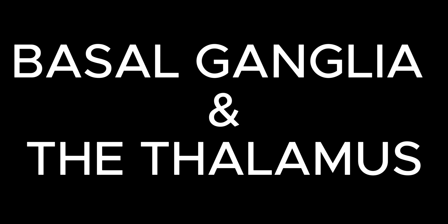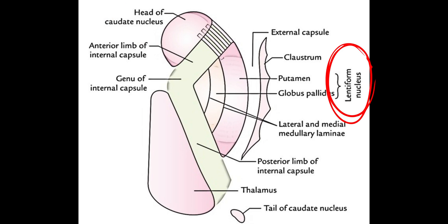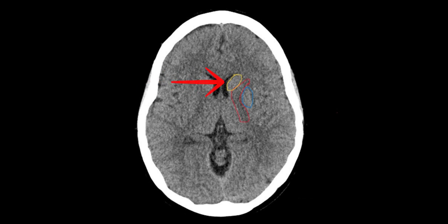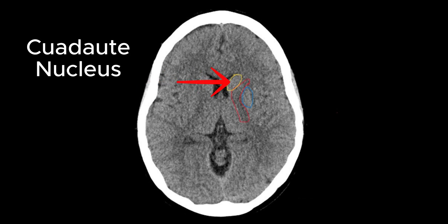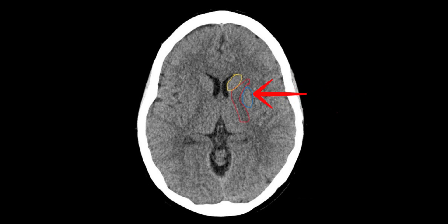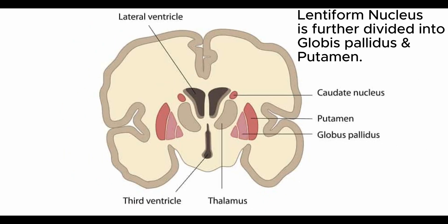These nuclei consist of basal ganglia and the thalamus. The basal ganglia is further divided into caudate and lentiform nucleus by the anterior limb of the internal capsule. This here, lying anterior to the internal capsule, is the caudate nucleus, and this one lying laterally is the lentiform nucleus, further divided into globus pallidus medially and putamen laterally.